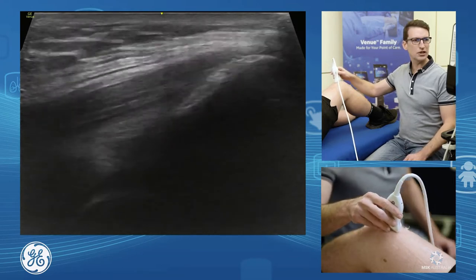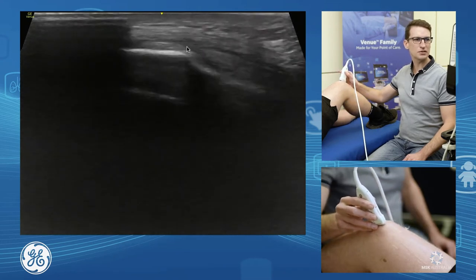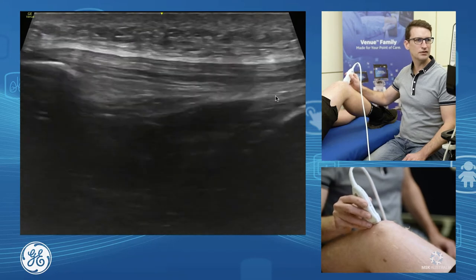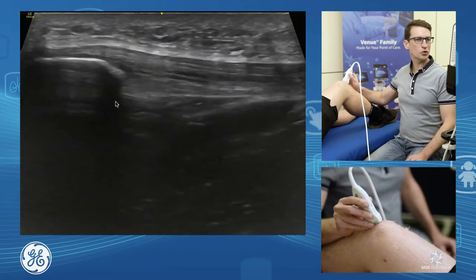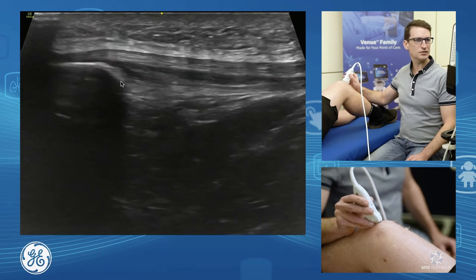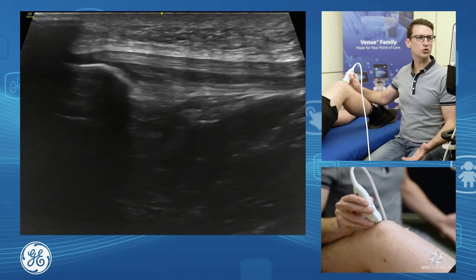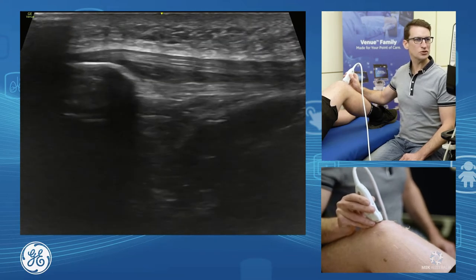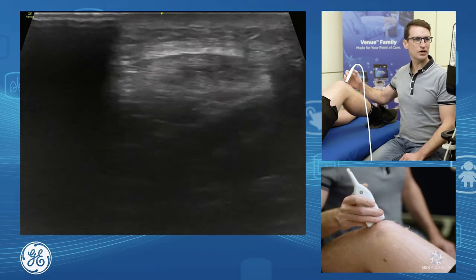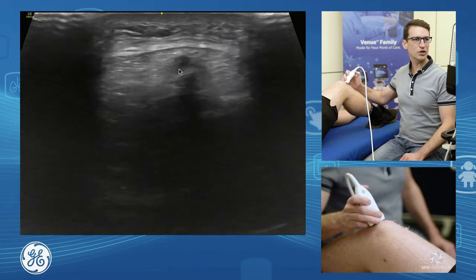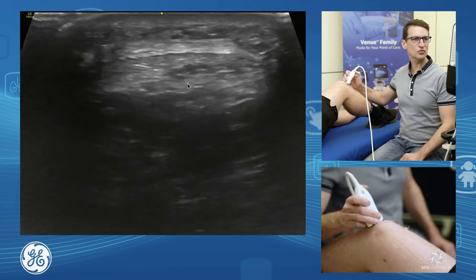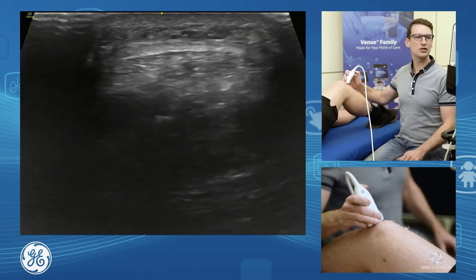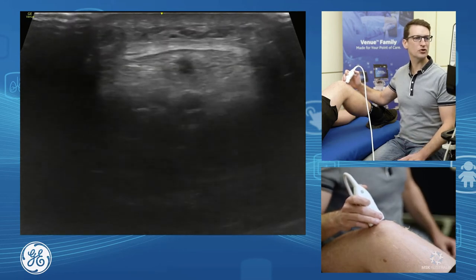As we continue down over our patella, we can see that continuation of the tendon, and then we come down into our patellar tendon. At our proximal end is where we commonly see our jumper's knee. Our patient has a little bit of hypoechoic change to that deep portion of the proximal patellar tendon. In transverse, we can see it's just mainly that central deep portion of the tendon, and we get that classic bullseye sign. This is just some really early tendinopathy — early jumper's knee.